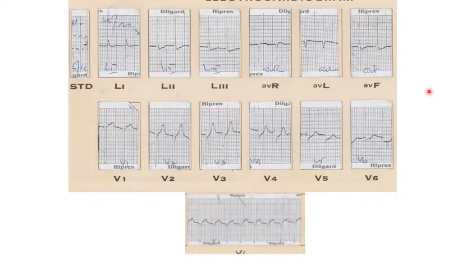Yes, sir. We can get it in the terminal part of the QRS, the pseudo S wave, seen in lead 2. Not in this one. I'm asking a question. In a patient with AVNRT, can you get the P wave outside the QRS complex? Sir, usually the 70 millisecond, I think it differentiates between them. RP interval less than 70 milliseconds is in AVNRT. I am not very sure.